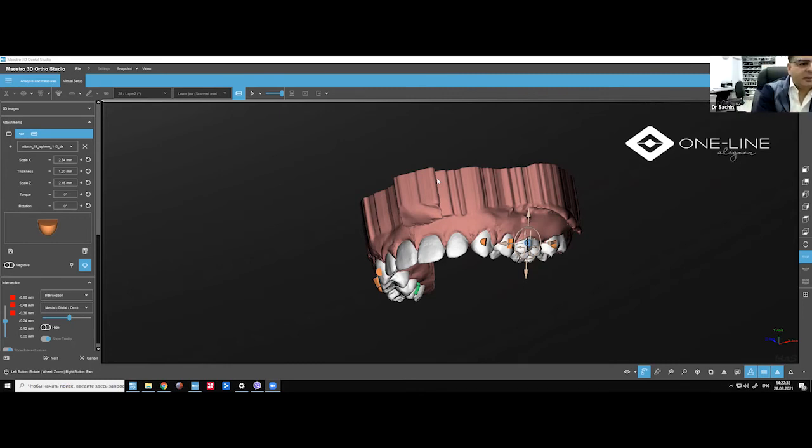Do you use the attachment on the lingual palatal side? Yes, we do. Can you show extrusion of upper lateral incisor? Yes. Extrusion of upper lateral incisor is a very, very big question. Everybody wants to know what we can do, especially for lateral incisors. I was talking with Dr. Nicozes. He developed a sash attachment. There are a couple of those yin-yang attachments, the sash attachment by Dr. Jonathan Nicozes from New York.